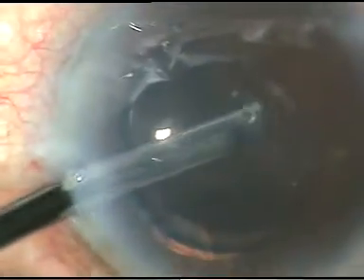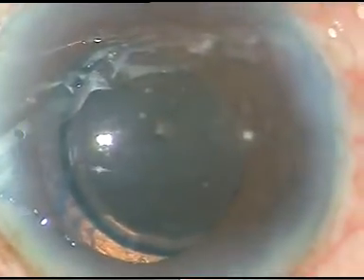Now I'm going through the 2 o'clock side port and removing the cortical lens matter from the right side of the main incision, that is from 9 o'clock, from 10 o'clock, and now it is coming nicely and vitreous is not disturbing at this time. Cortical matter from 7 o'clock, 6 o'clock has been removed.